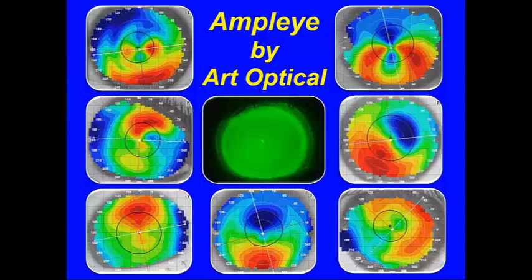No, you don't. The power of the tear lens trapped beneath the scleral lens is determined by the curvature of the cornea and by the curvature on the back of the lens. If neither of those changes, the thickness of the tear lens increases, but its shape doesn't. Therefore, it is not necessary to make any power adjustments.